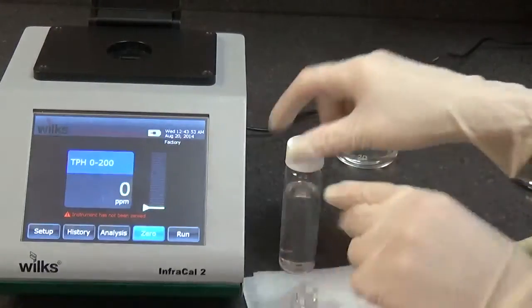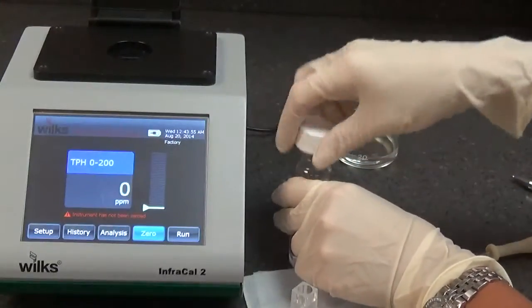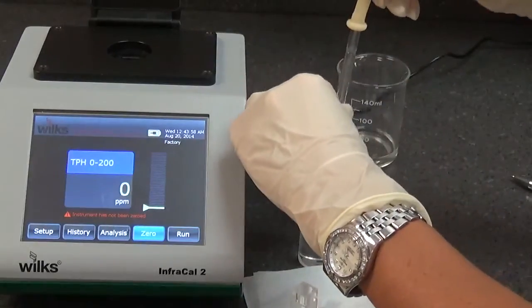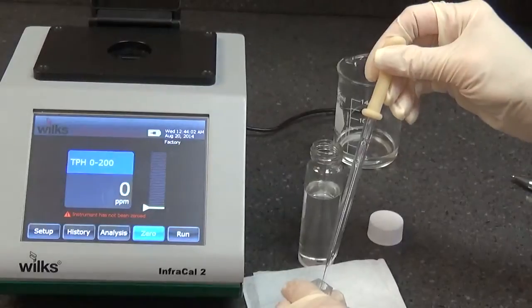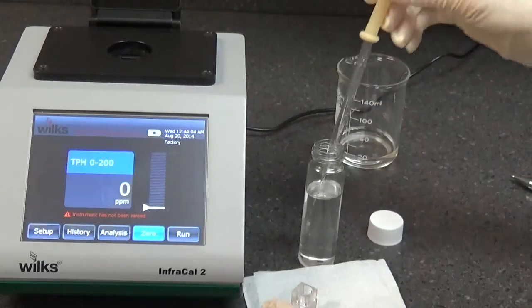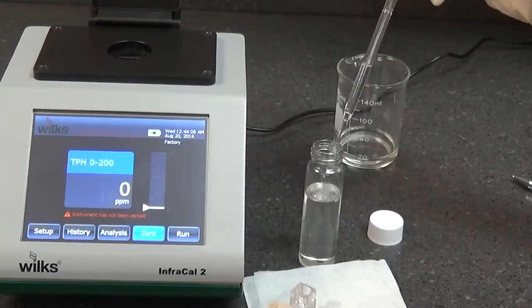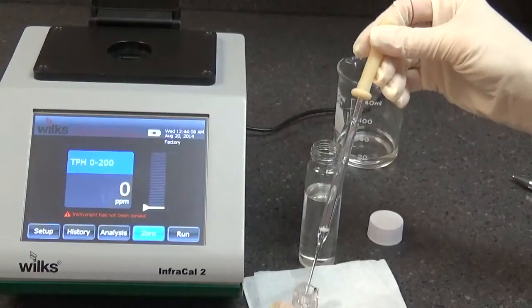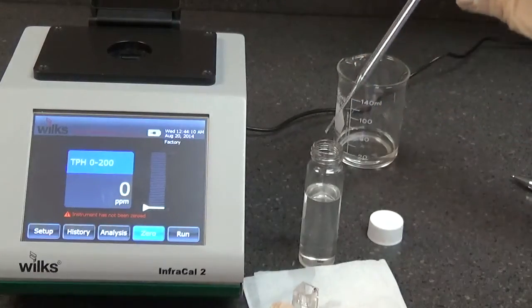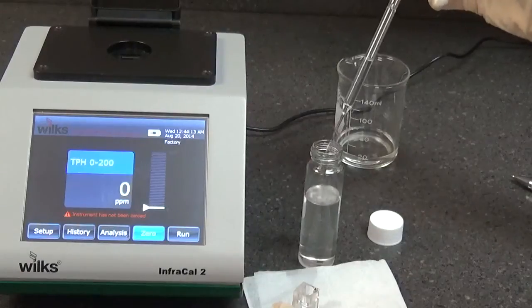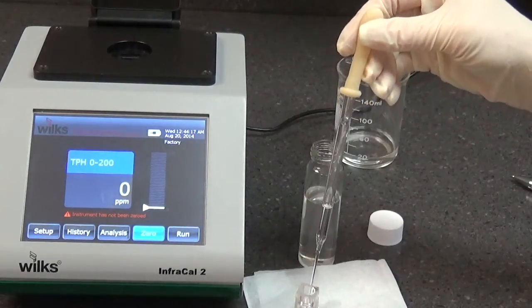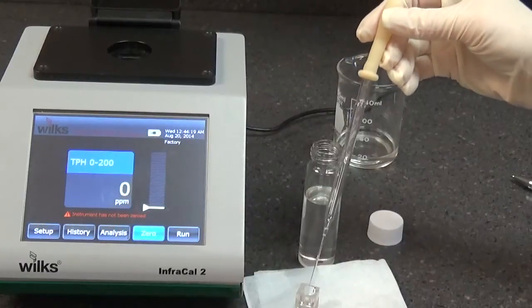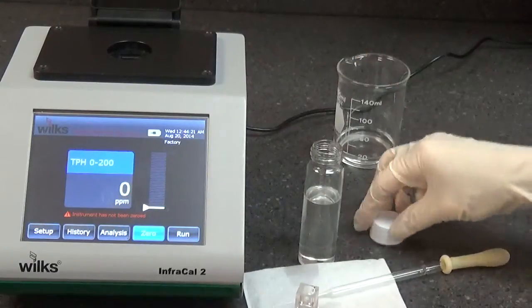Zeroing the analyzer. The frequency for zeroing depends on the required sensitivity. For levels above one ppm, every one to two hours should be sufficient. Fill the cuvette with the same clean solvent that you will be using for the sample analysis. Insert the cuvette with the frosted side facing toward the front.